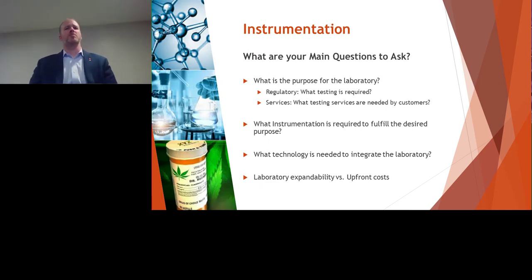So instrumentation, we'll start off there. The main questions that you want to ask whenever you're looking at setting up an analytical lab is, what is the purpose of your lab? Are you a regulatory lab? So you're following very specific requirements that are handed down through a government body or something for your particular client.